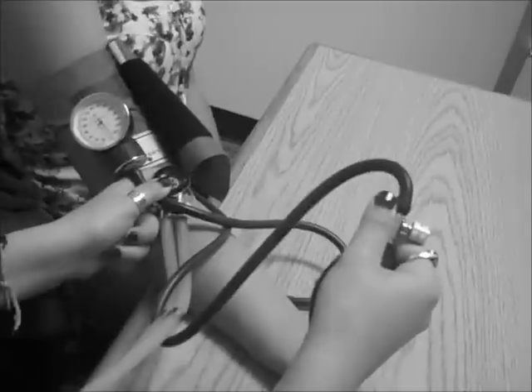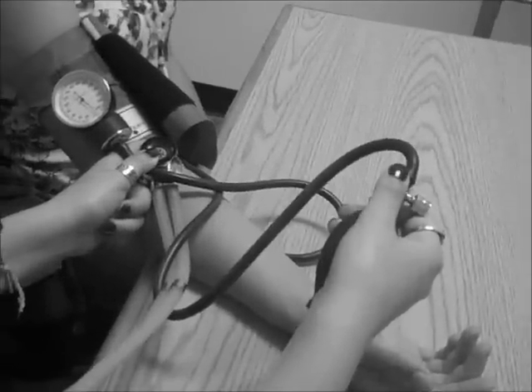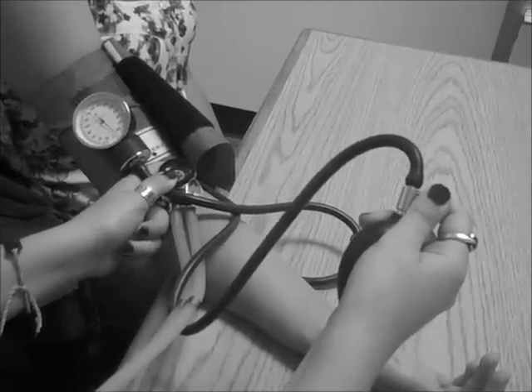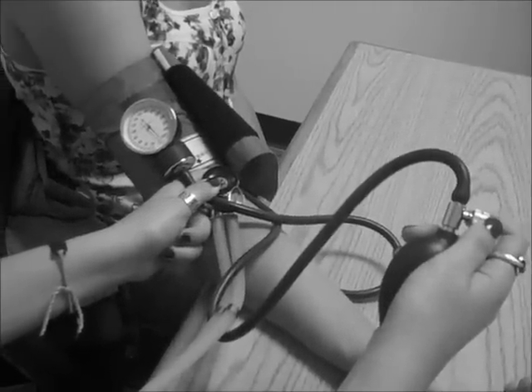Now slowly turn the knob on the air valve to release air from the cuff. As the pressure slowly drops, listen for the sound with the stethoscope. When you hear the first sound, note the pressure on the dial — that is the systolic blood pressure. When the sound disappears, that pressure will be the diastolic blood pressure.